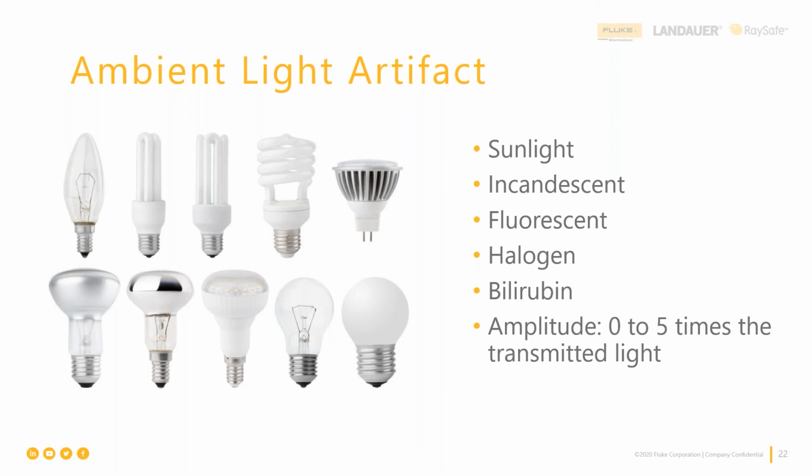So what was happening is the light from the fluorescent lights above the patient in the OR or in the ICU, which is typically where we made these measurements initially, was causing wrong measurements to be made because it was responding to that light flicker and not to what was really happening in the absorption in the physiology. So sunlight is another thing that was happening that was really making it difficult for getting the right measurement.